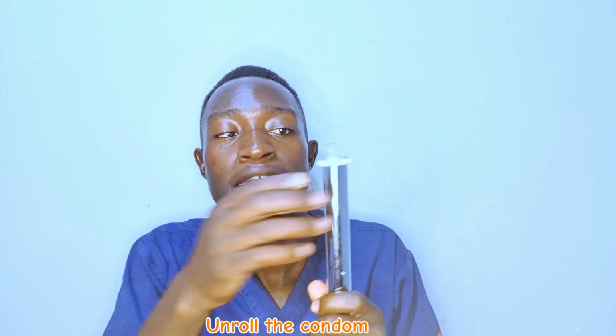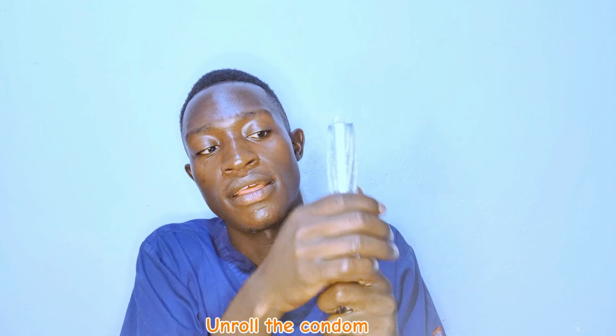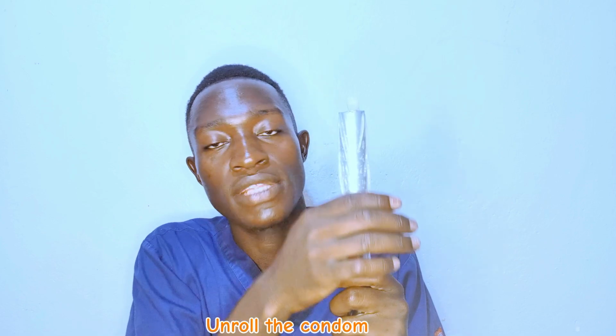After placing the condom on the head of an erect penis, you just unwrap it. Just do like this. You see? You just unwrap it like that. You push it slowly towards the shaft of the penis.